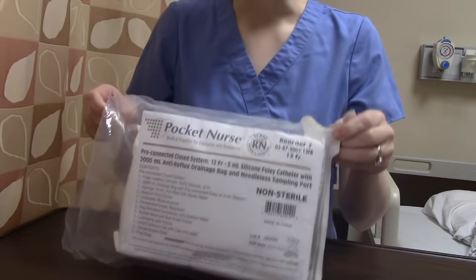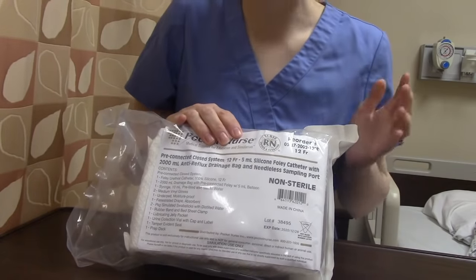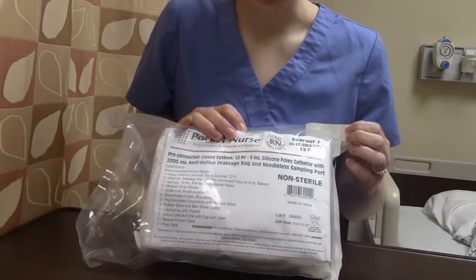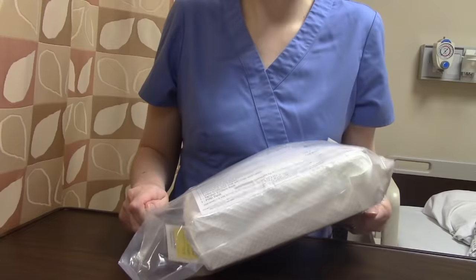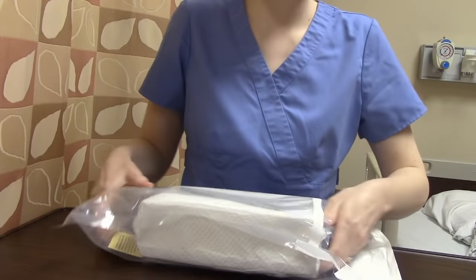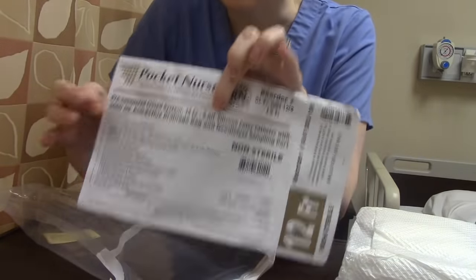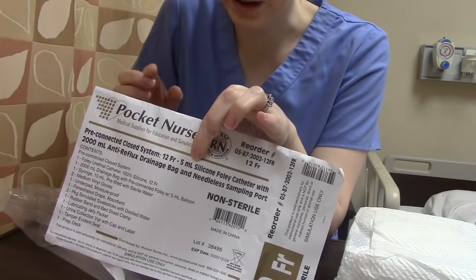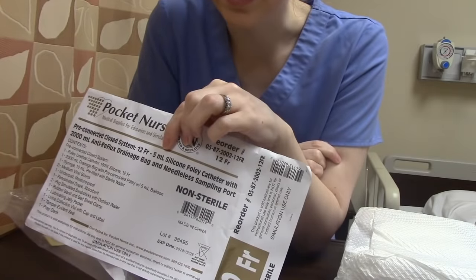We have our Foley kit. It says this is a 12 French — that's the size of this catheter. Standard adult sizes are 14 to 16; this is a practice one. Also note it says 5 mLs — that's how much the balloon should be inflated to. The kit comes with a syringe that goes to 10 mLs, but that doesn't mean you use all 10. Go to whatever the packaging says; it will also say it on the catheter tubing.